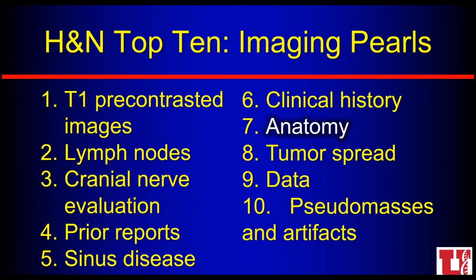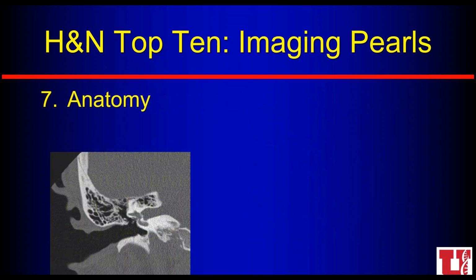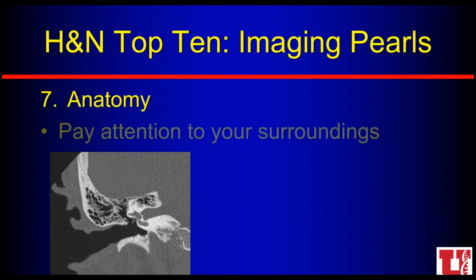So our next important area is anatomy. We think about the anatomy in the head and neck world, and we want to always think about paying attention to our surroundings.